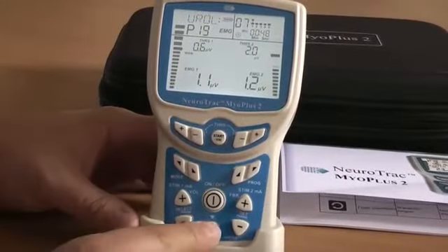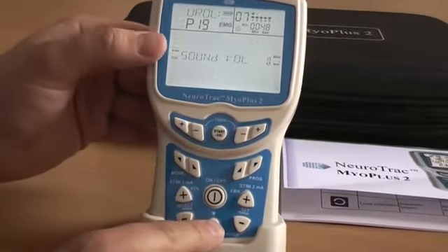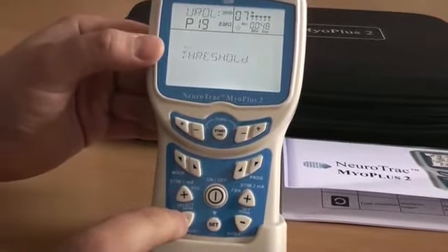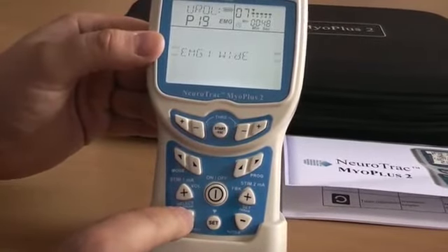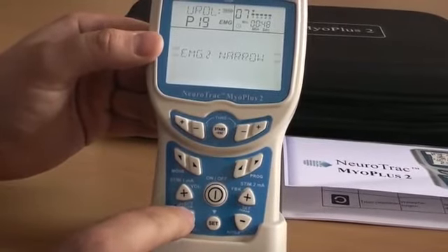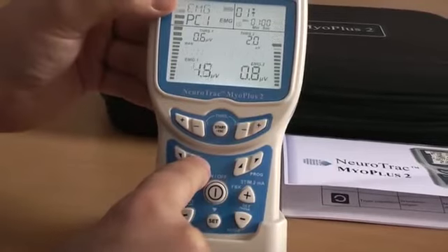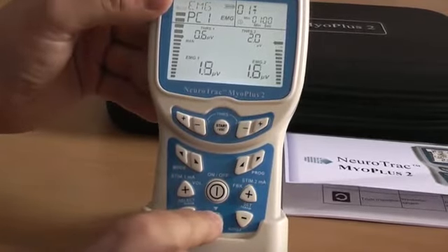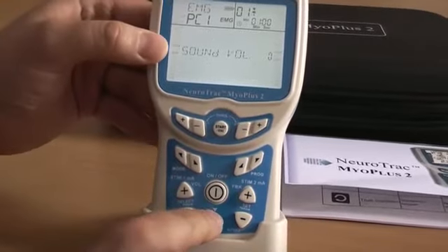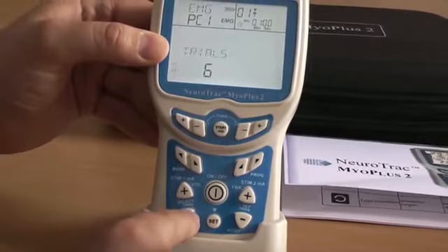By pressing and holding the Set button, you can change, for example, sound volume, auto or manual threshold, bar graph sound, EMG filter, and the PC connection status. If you cannot find the parameter you want to adjust, you can find it in one of the custom programs. Press Mode to go to EMG Custom. Here, press and hold Set, and here you can see all the available settings: work time, rest time, number of repetitions, and many more.